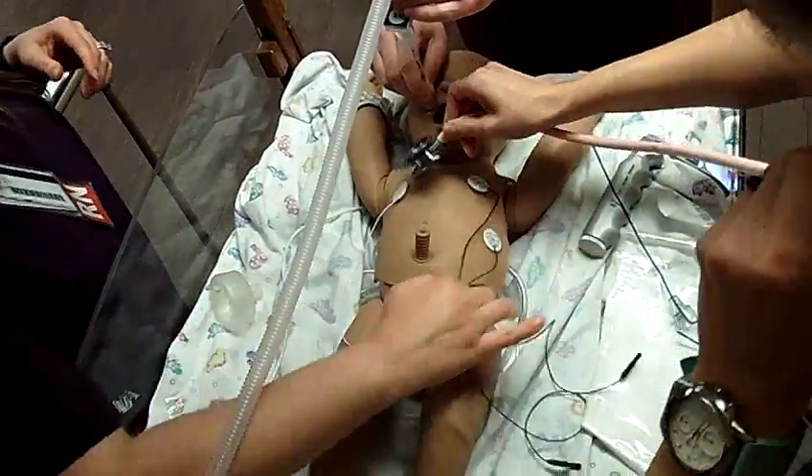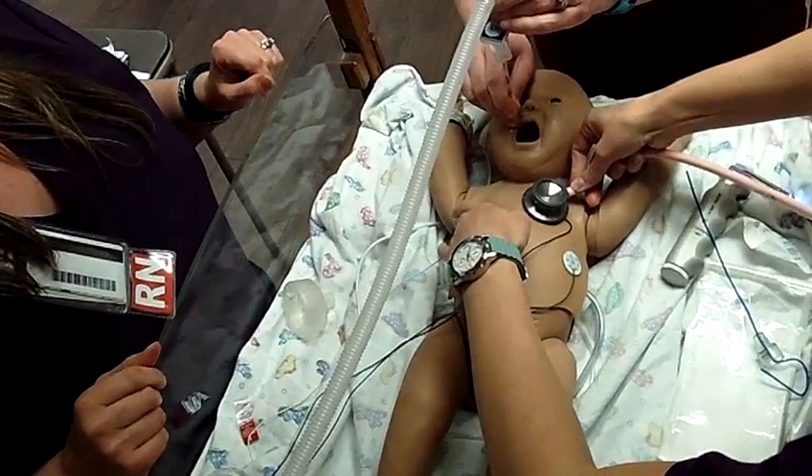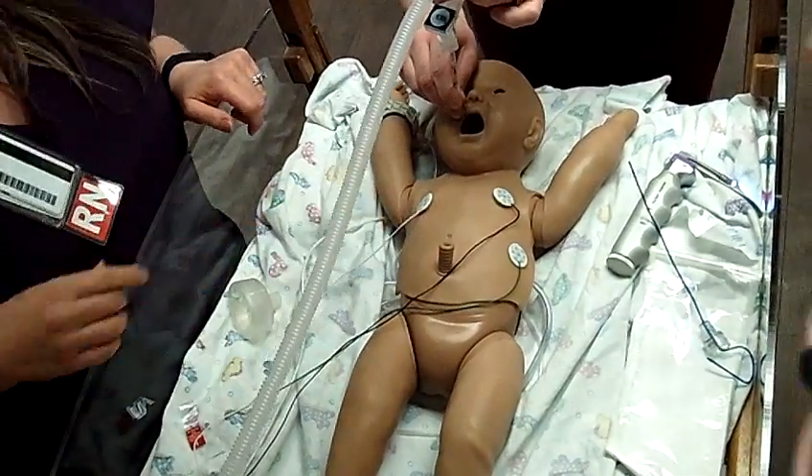Okay, let's listen. Breathe, two, three. Breathe, two, three. Breathe, two, three. We have breath sounds on both sides. CO2 is turning yellow. Equal chest rise.